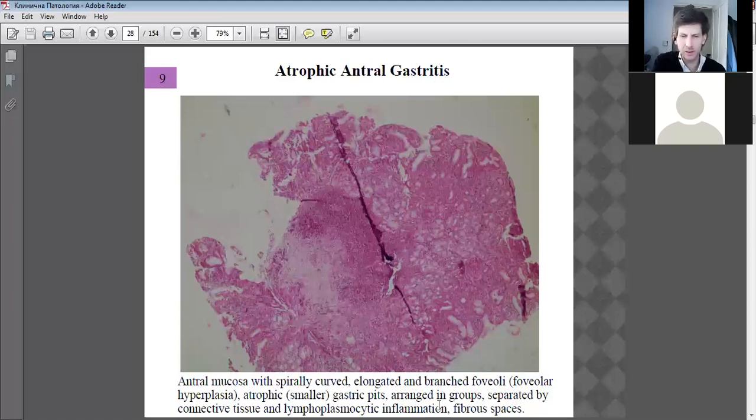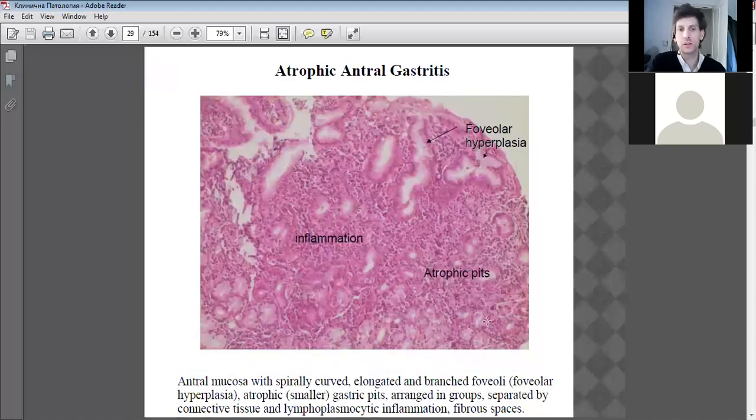I think he mentions smaller gastric pits. Yeah, smaller gastric pits. So this is indeed in the stomach. The stomach will be producing less secretions, less acid, hydrochloric acid, and less pepsin. Okay, so the inflammation could be caused by bacteria or could be caused by an ulcer. So we move on to the next bit. And if you've got any questions, please don't hesitate to ask.